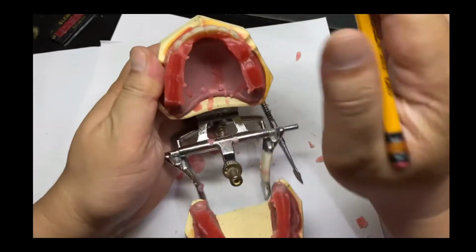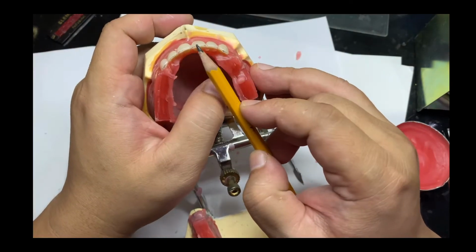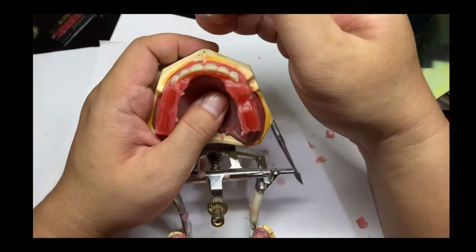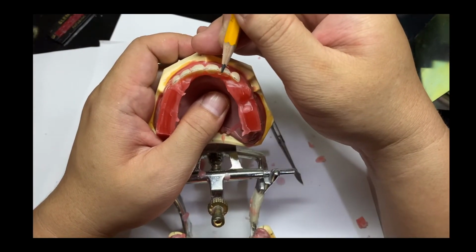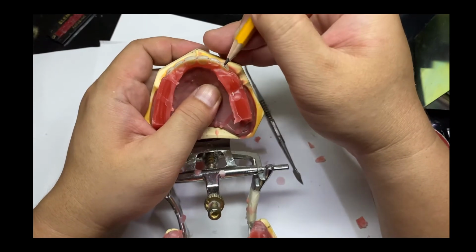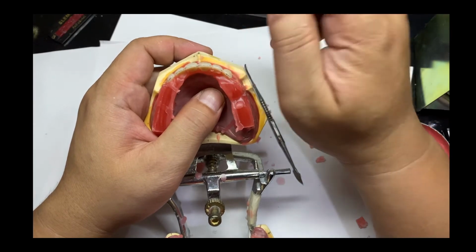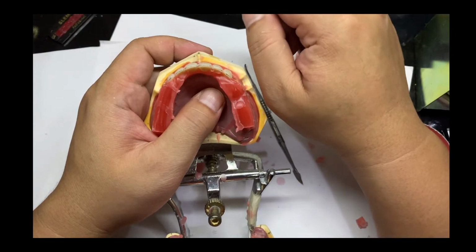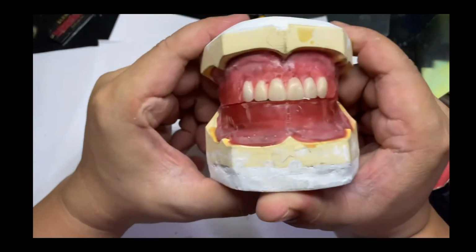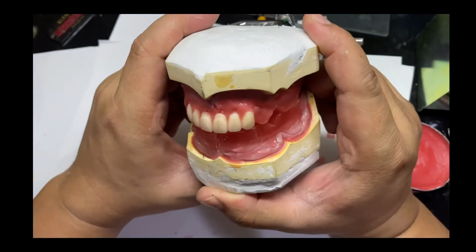All the lines should be connected from central incisors to lateral and then canine. So distal of the central, mesial of the lateral, distal of the lateral, and then mesial of the canine. They are all connected. If one of those lines is not connected, it means one of the teeth is not properly set. Now again, let's check the setting. That's for the upper anterior.